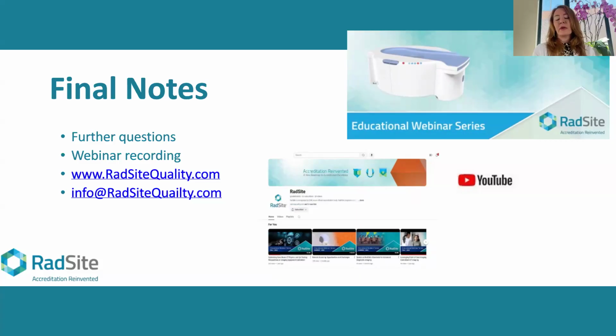Right. The state of California requires it to be somebody who is specifically trained in handling radiologic breast imaging, so a mammographer. But honestly, it's so easy for our techs. There's really not much to do. It's just making sure that all the settings are correct, that everything is done safely. But there's not a lot of positioning. There's not a lot of specifics that needs to be done for the test. It's basically just making sure that the images are procured and sent to the PACS system correctly. It's really more image handling and from the computer side of it rather than the patient side of it.